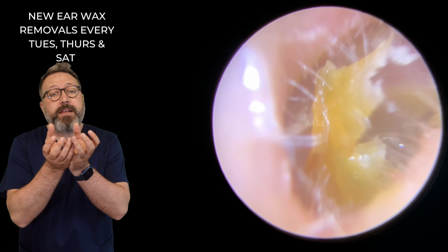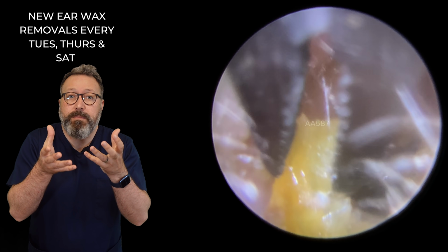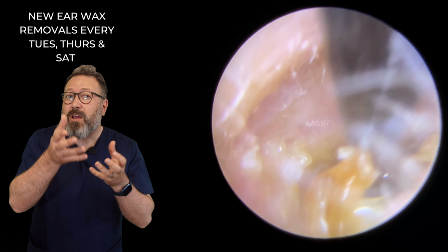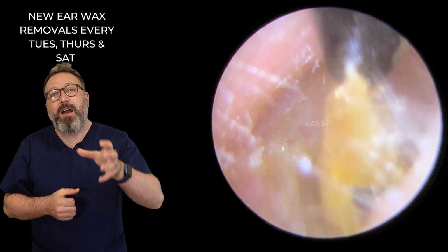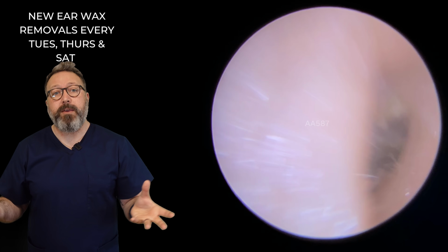But what effect it has is it softens the skin. So as we were trying to pull those really hard chunky pieces out, it really wasn't coming away very well. But when you soften it with a bit of olive oil, look at the difference it makes. The skin is peeling away from the canal wall. The dead skin is coming away from the canal wall really easily. And when we lift this up, you can see you get these long strips now coming away.